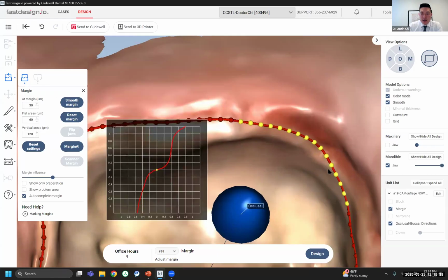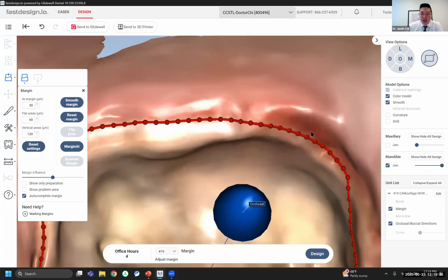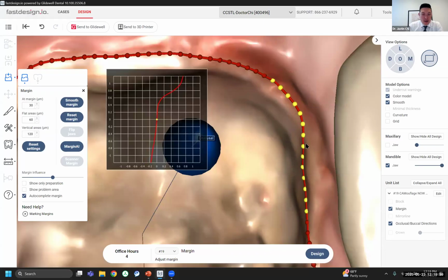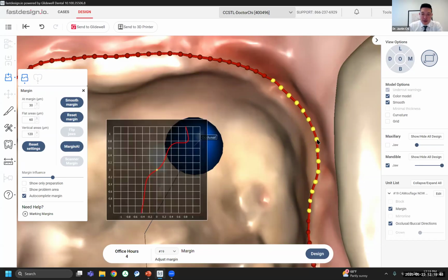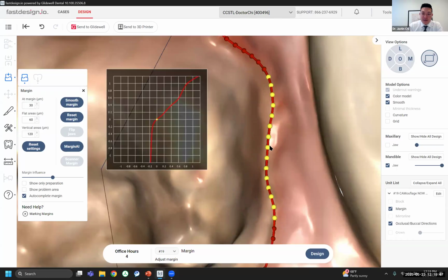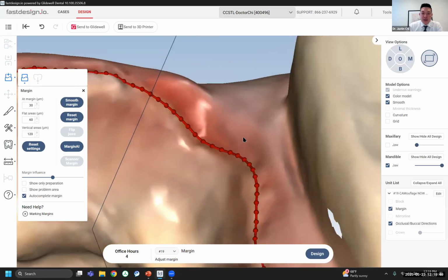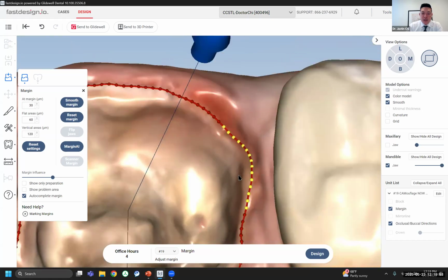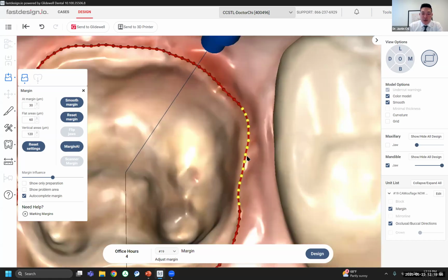I didn't talk about it during the prep scan, but of course, making sure you've captured the field, you want the field to be dry as possible. It definitely enhances the scanner's ability to capture the field most accurately. This is that distal lingual zone where we're kind of getting subgingival, just following where that tooth structure goes.